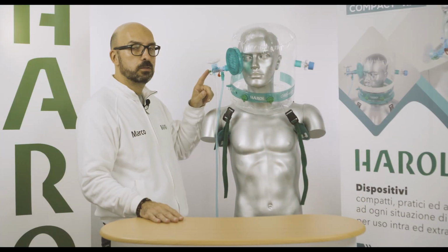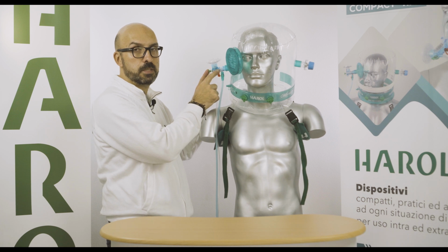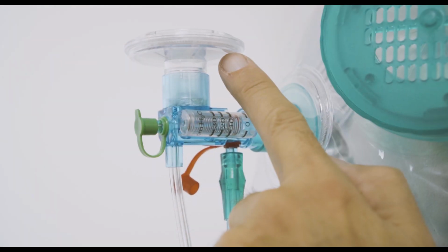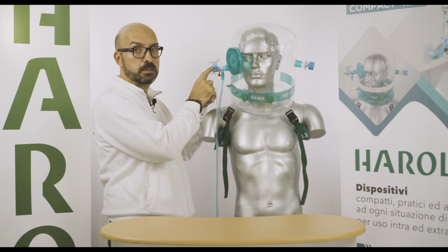As mentioned, a pressure gauge is integrated on the compact Venturi to display the pressure inside the helmet at any time. An HEPA filter is also integrated in the Venturi to reduce bacteria and dust that come in contact with the patient.